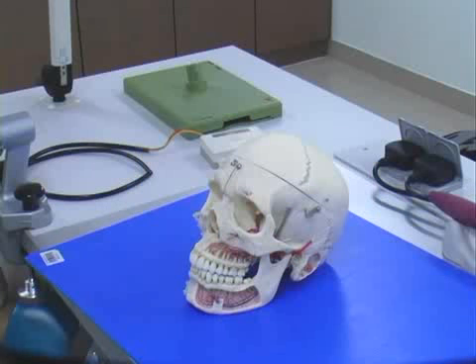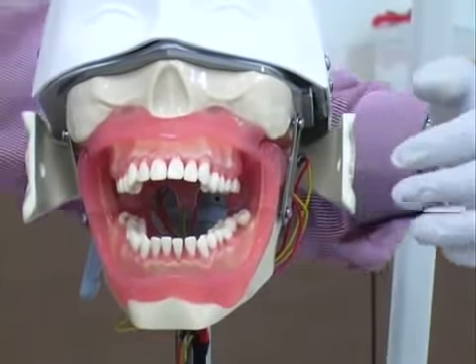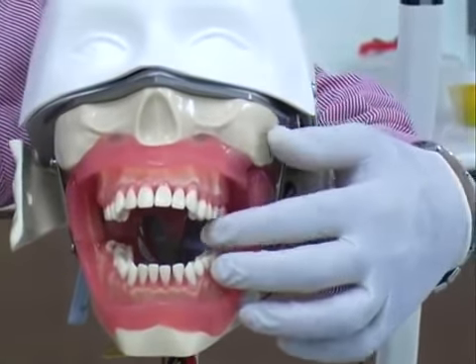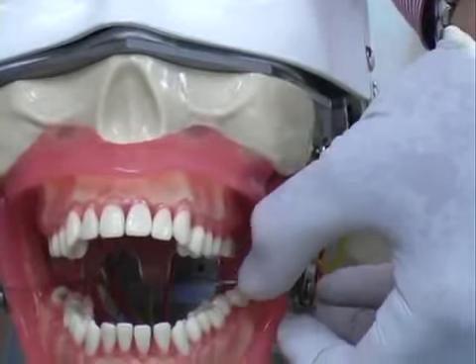Move now to the mannequin model for the administration of inferior alveolar nerve block. This is a mannequin model which we are going to use for administration of inferior alveolar nerve block.